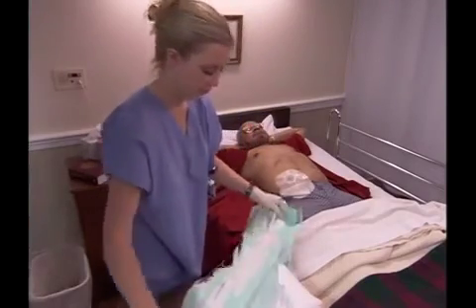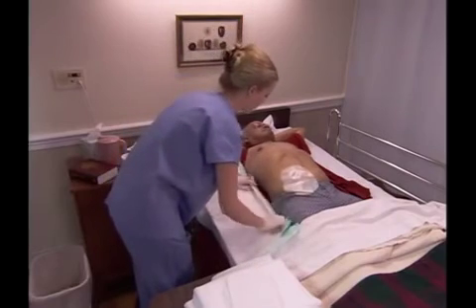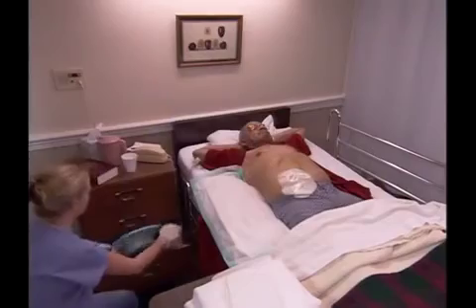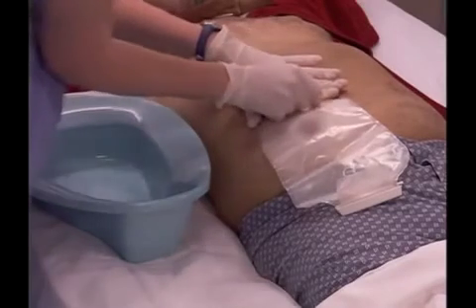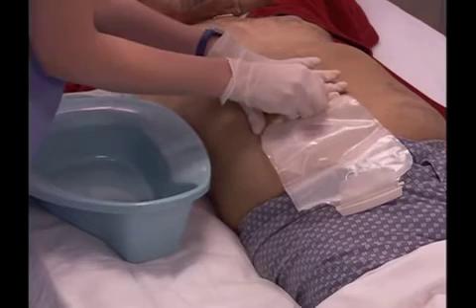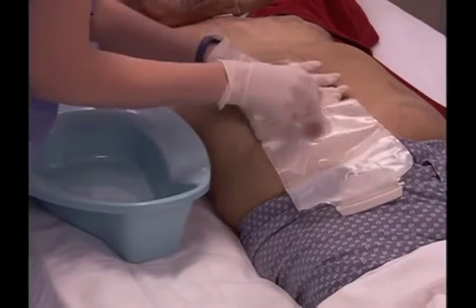Position the bed protector alongside the person to keep the bed linens dry. Then place the bedpan on the bed protector. Remove the ostomy appliance by holding the skin taut and gently pulling the appliance away, starting with the top edge. If the adhesive is making removal difficult, use warm water or adhesive solvent to soften the adhesive.